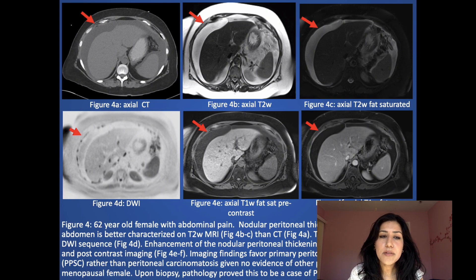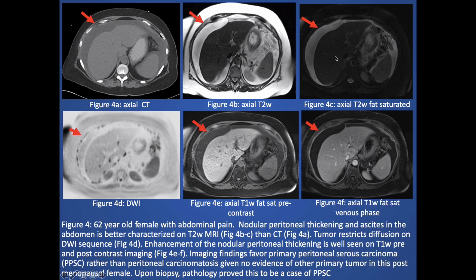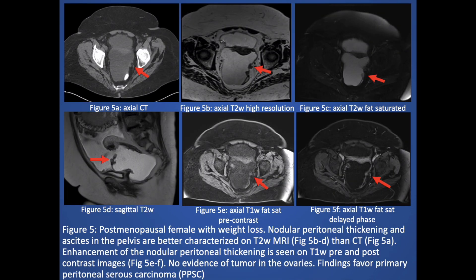Here is a 62-year-old female with abdominal pain. On the CT images, there is ascites and ill-defined nodular thickening. This is better characterized on the adjacent MR images. The tumor restricts diffusion on the DWI sequence and shows enhancement on the dynamic images. These features favor primary peritoneal serous carcinoma rather than peritoneal carcinomatosis, given there is no evidence of another primary tumor in this postmenopausal woman.